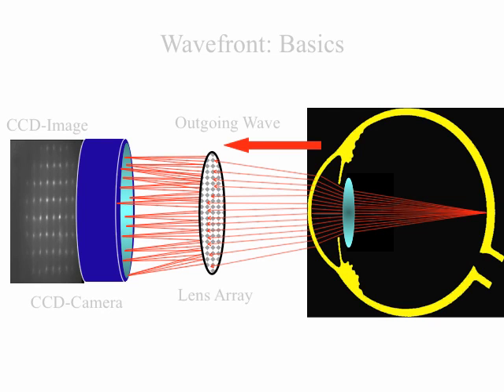Okay. We're going to create an aberrometer. It's going to be very simple. And we're going to do it again by illuminating the retina and looking at rays of light coming out of the eye and measuring the aberration of the wavefront coming out of the eye, because that's a description of the aberrations that are going to be produced going into the eye.